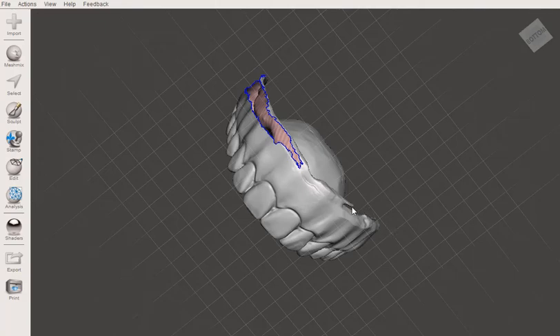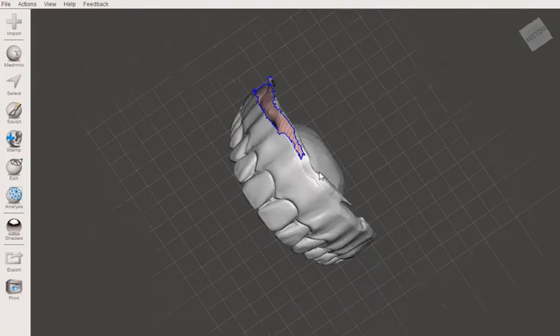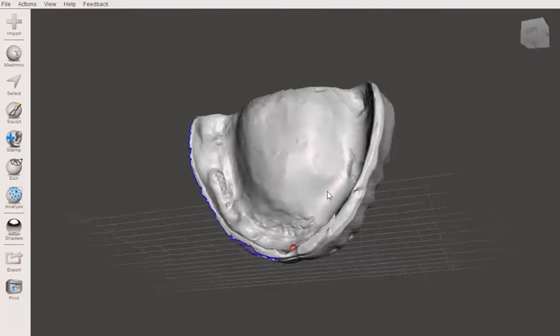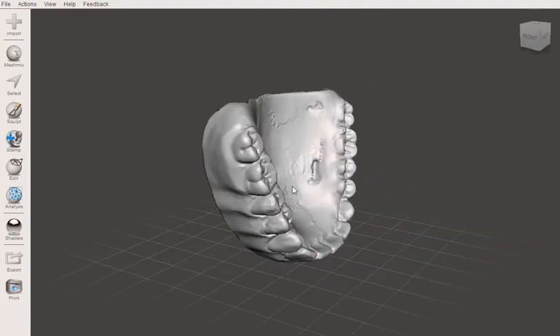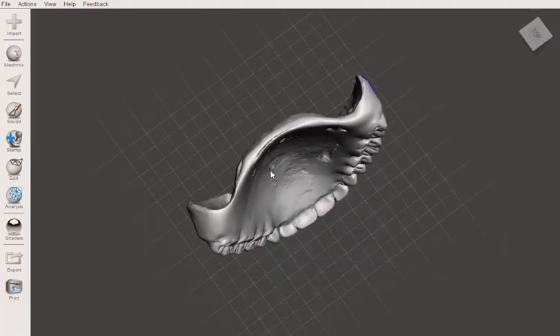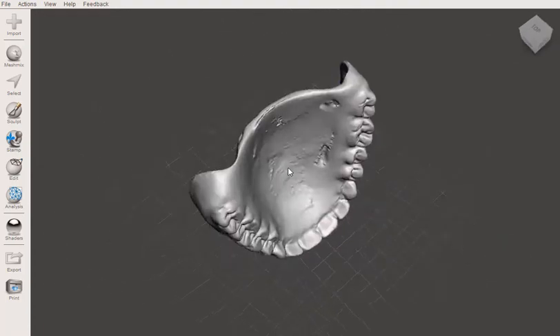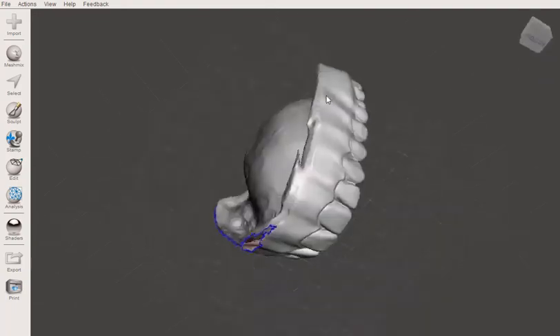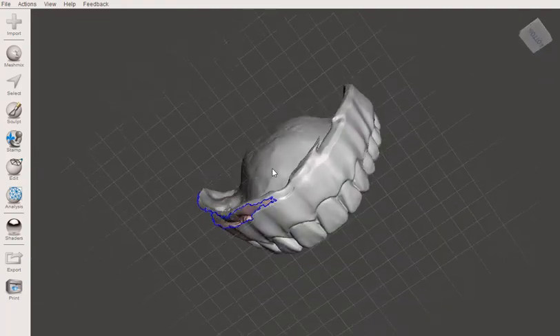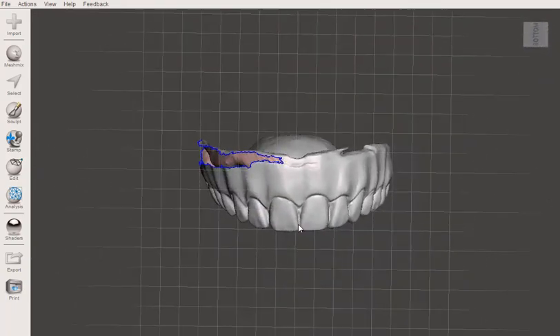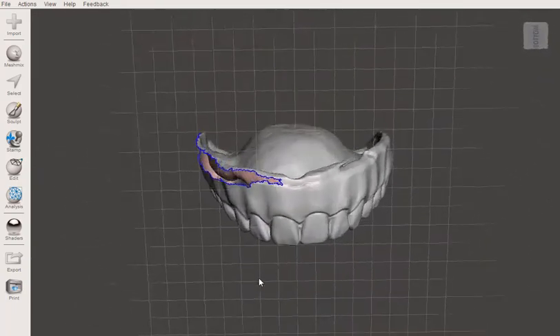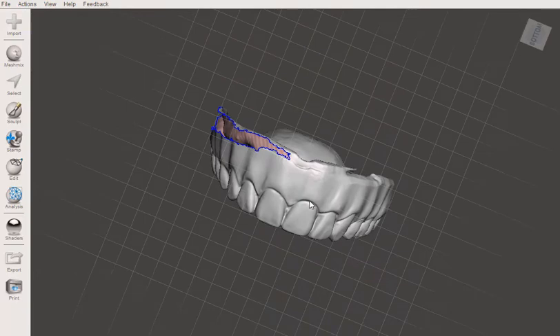Hey gang, Matt here. I wanted to do a quick video. Here we used our CS3600 to scan a patient's existing dentures. We're going to be changing them up a bit.